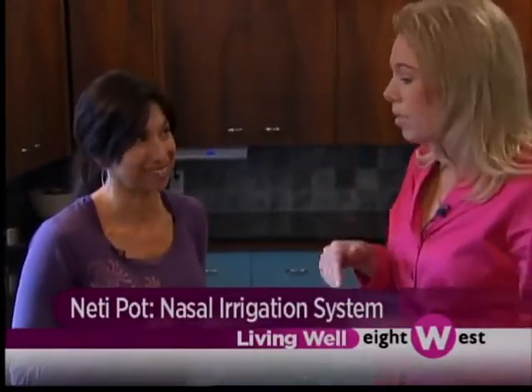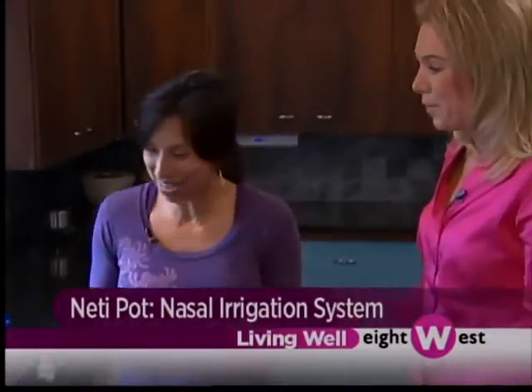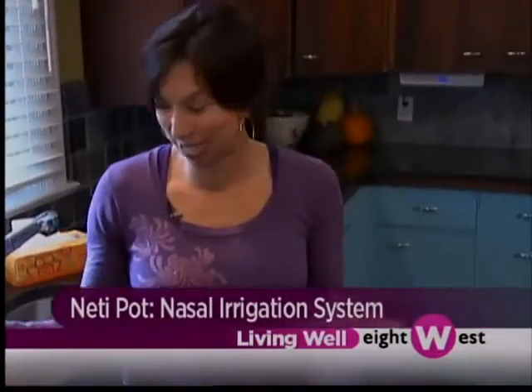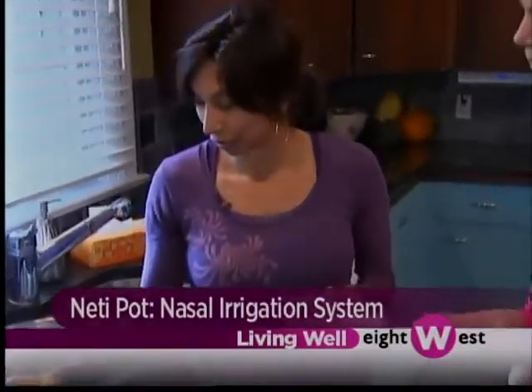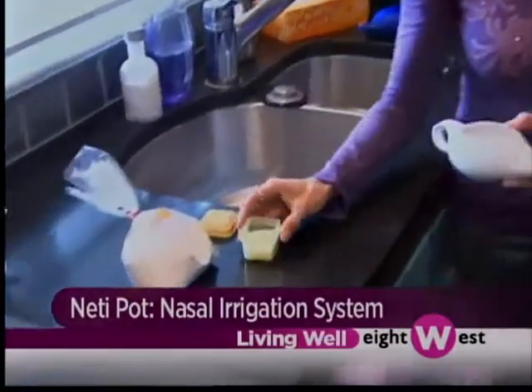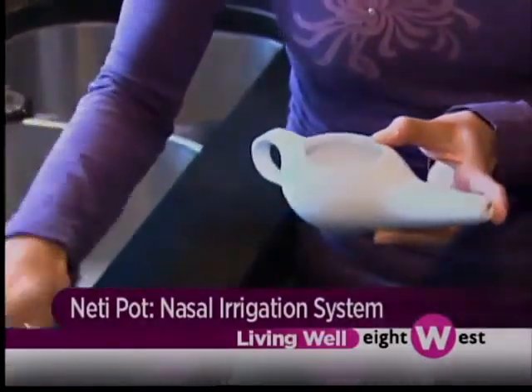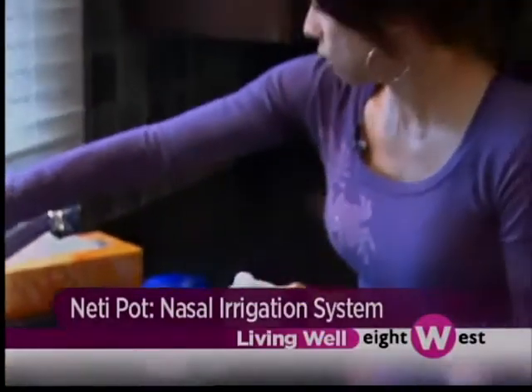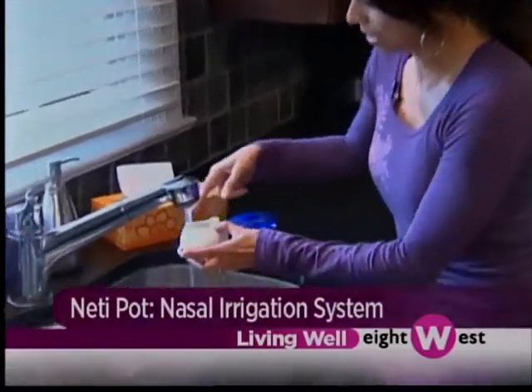Saline water. Yes. All right, so you don't usually do this in your kitchen. No, I don't do this in my kitchen on a regular basis. I do this in my bathroom, but just for space, for layout, lighting purposes. Okay, so you just put a little bit of sea salt. Right, so I buy this bulk sea salt, and I'm going to put about a quarter teaspoon in, and I kind of eyeball it. Some people might measure it. And then you want to use some lukewarm water for this, and this is about the right temperature.